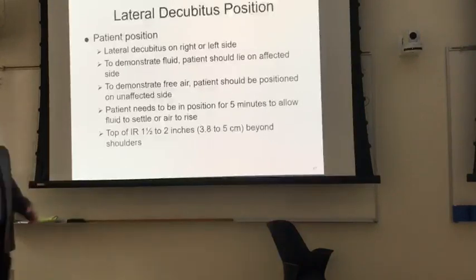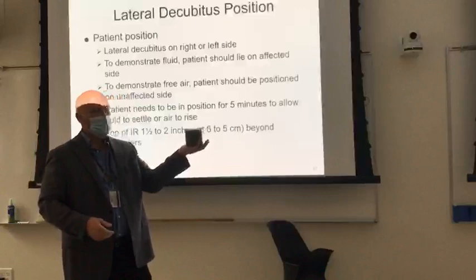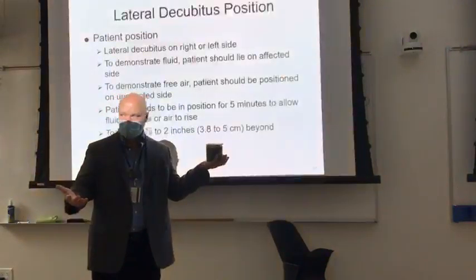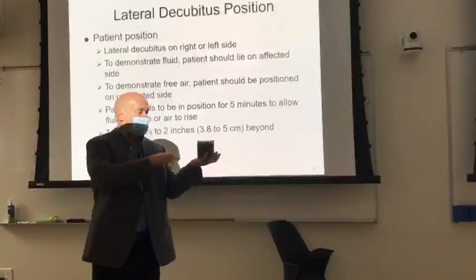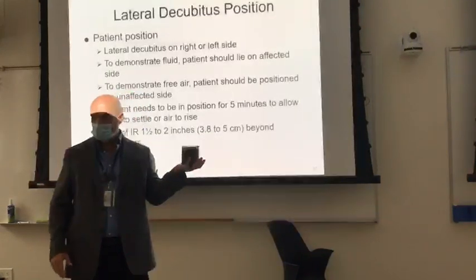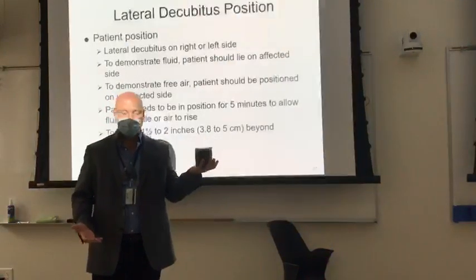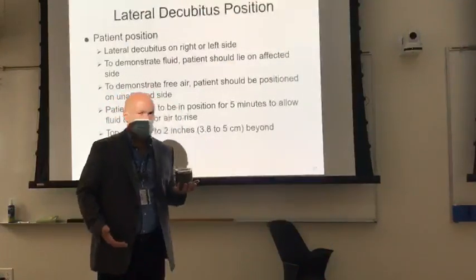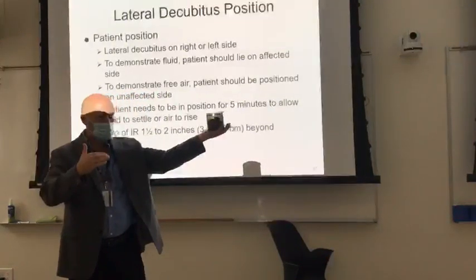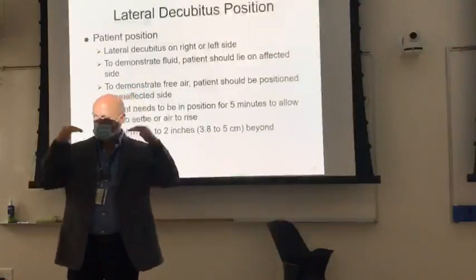Okay, so let's make believe this is a clear cup. All right, so it's clear, it's a measuring cup. So you're making something, and you need a precise measurement, right? So it's a clear measuring cup, and it's got lines on it. So how do you visualize that you've got just the right amount of water in the measuring cup? You look down on it like this? Look from the side? No, you look at it like that. You get on eye level with it, okay? So decubitus, every time we shoot a decubitus, that's what we're trying to visualize, their fluid levels.